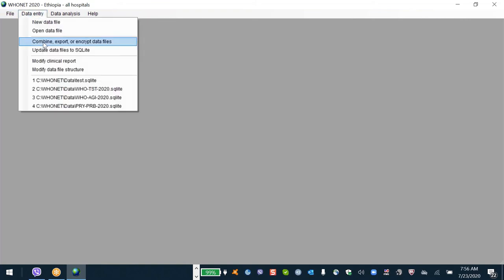Is that still unclear? These are three very different uses. They overlap in the general ideas. So first of all, combine is never needed. There's no reason you ever have to combine data. You combine data only out of convenience. You have 12 files, you've just prepared one file. So the reason for combine is simply convenience.